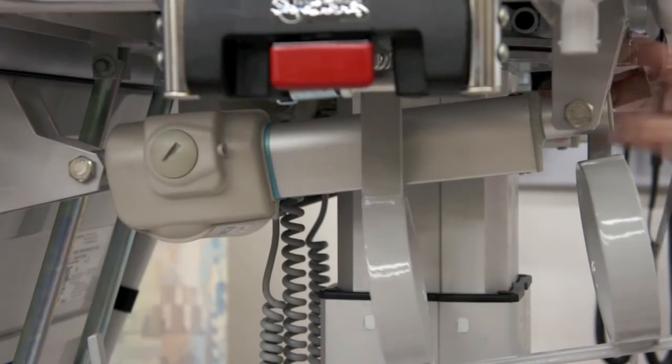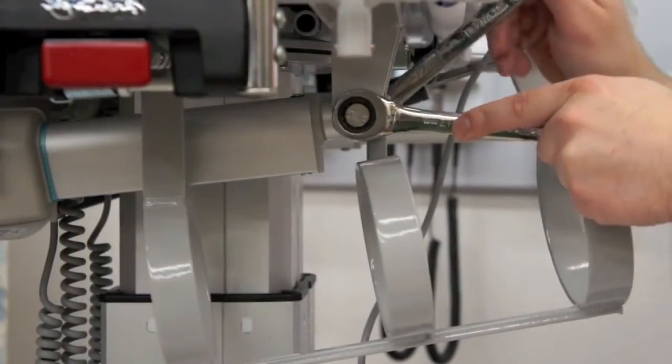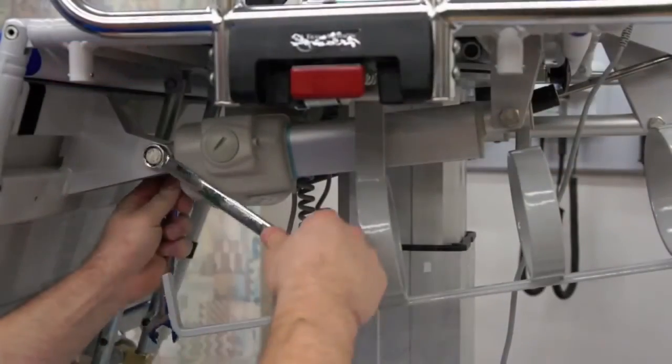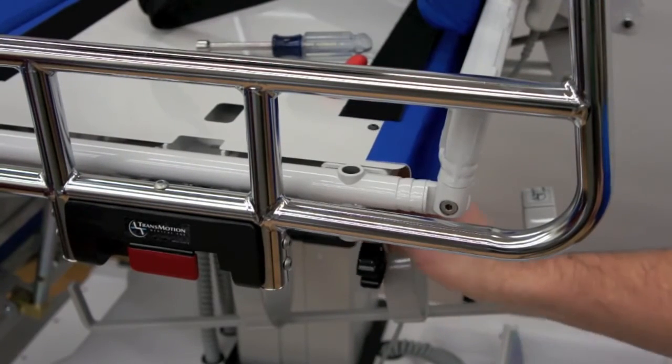Then secure with the nuts and tighten. Be careful and do not over tighten. They will begin to make a squeaking noise when tight enough. Reattach the seat pan and take the four screws and tighten until secure.